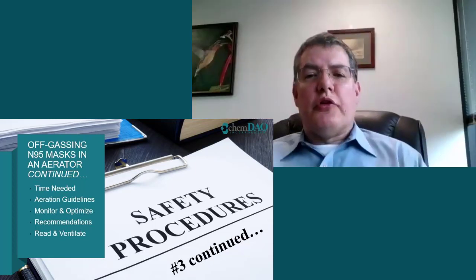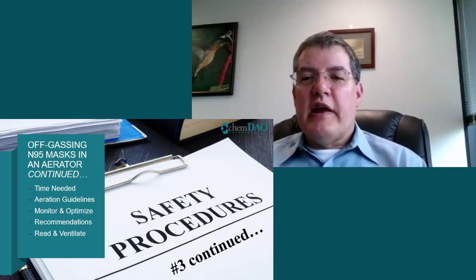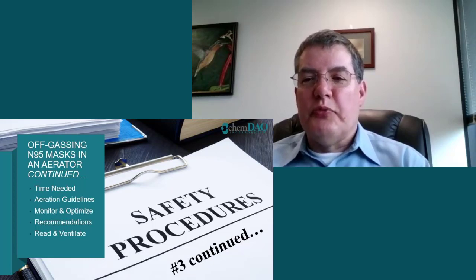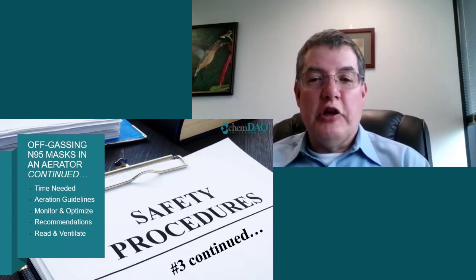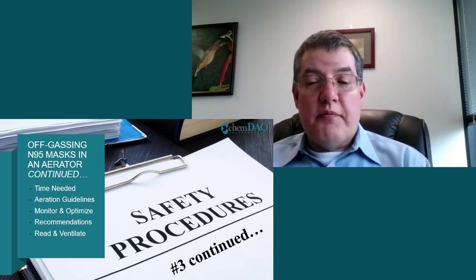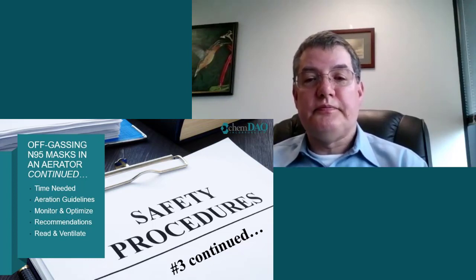Yeah, good question. Even though the masks have not been cleaned, each one should be placed in its own Tyvek pouch or equivalent. And so the risk of grossly contaminating the Sterrad or V-PRO sterilizer is so small that in most cases cleaning should not be necessary before using it on normal loads. However, if there is any visible residue after disinfecting the mask, then the sterilizer should be cleaned.